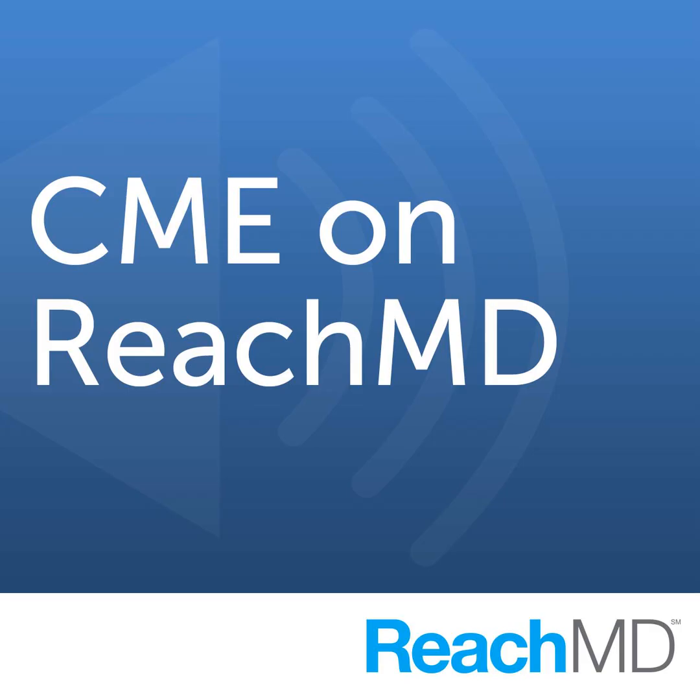So how does imaging help? Well, we are lucky. We have all these different imaging modalities that we can use to help in the assessment of patients with hypertrophic cardiomyopathy. And we're going to hear a lot about that in this session today. But we have echocardiography. That is the first line test. That's what we go to first of all when we're assessing people with heart muscle disease. And of course, that's the same with hypertrophic cardiomyopathy. Frequently, we're using MRI to help in the diagnosis, but also to risk stratify patients.